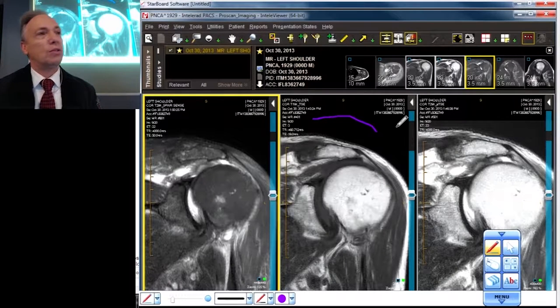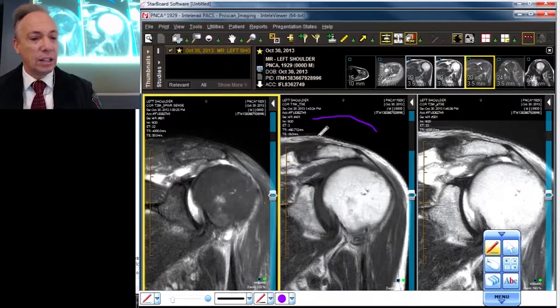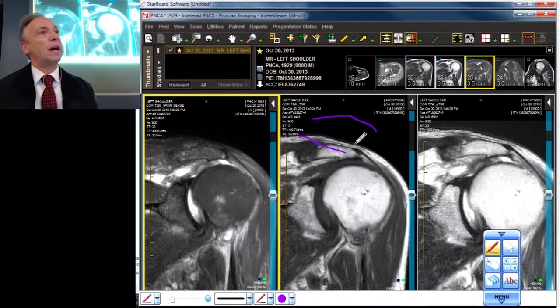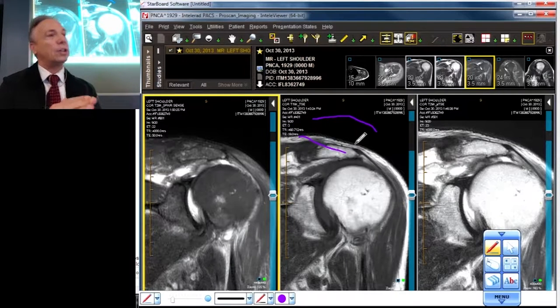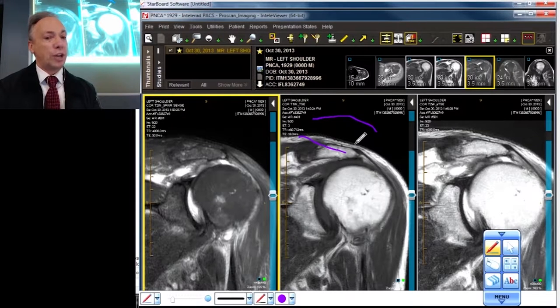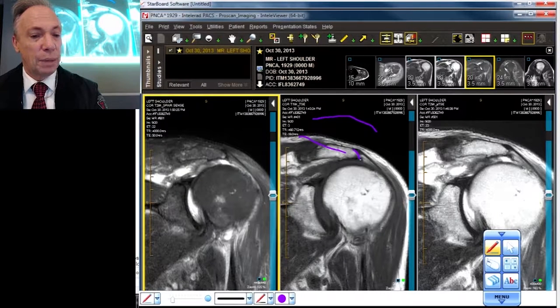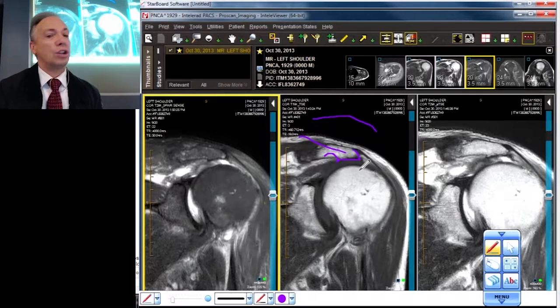There's even a categorization called the Bigliani subtypes of the acromion, but I hardly ever use that. What I do use are proper descriptors. I look at whether the acromion is down-sloping in the coronal projection. I rarely measure things, but I do look at them. I also pay attention to the shape of the acromion — very often people with anatomic impingement have an acromion with a little shelf on it that looks like the end of a telephone receiver.